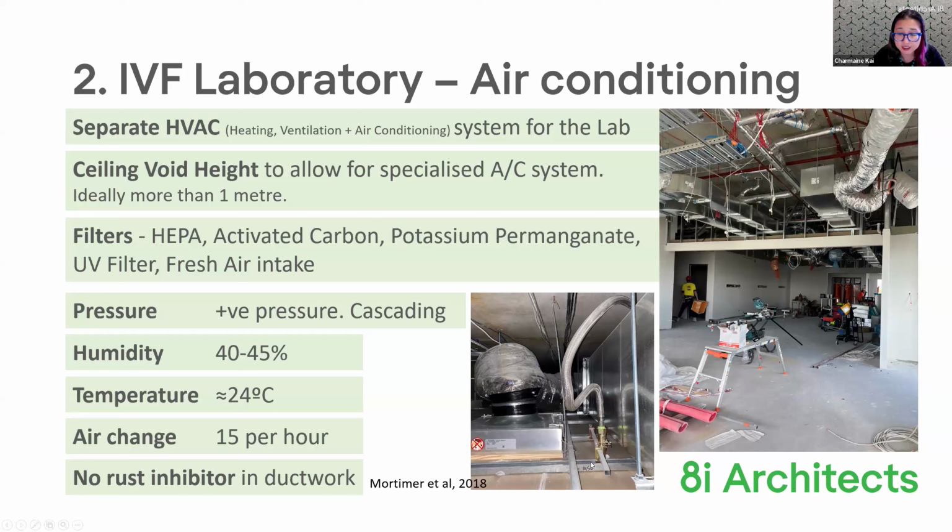So the steel you see down the bottom is the ceiling grid that's holding up the ceiling within the lab. So you can see that having as much height as you can is advantageous. It just makes it a lot easier to also clean and change out filters as well. So that's something to think about. So we'll talk about filters.